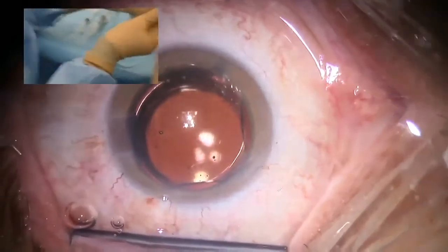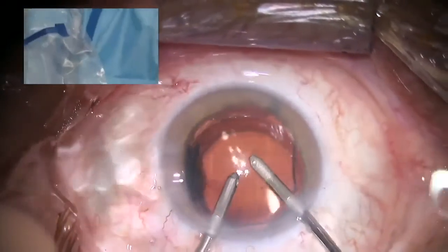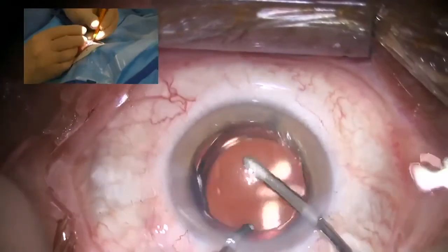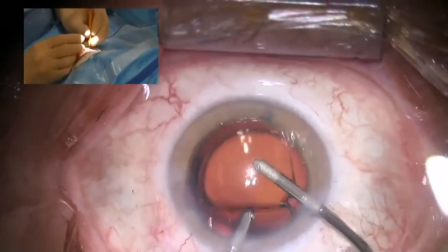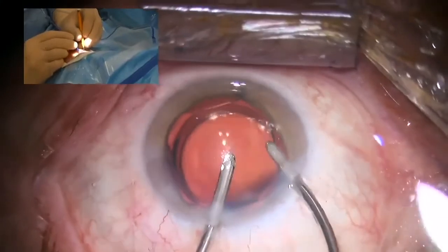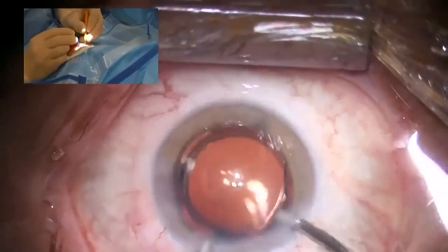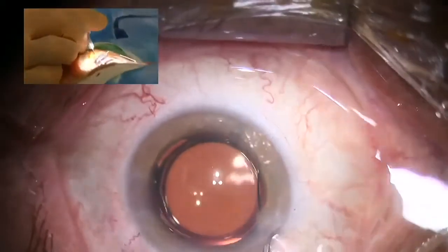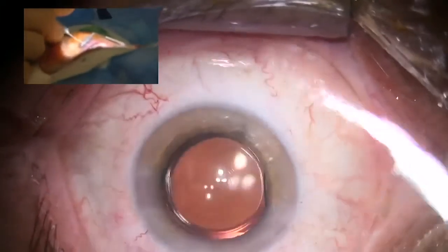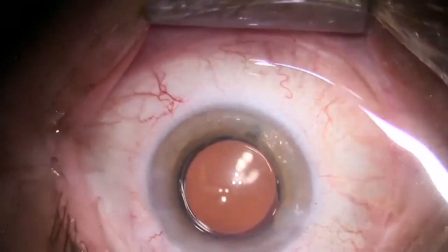Centration. This is very important for me to check that there's no viscoelastic remnants between both lenses. So, here you go. Thank you. So, that's it.